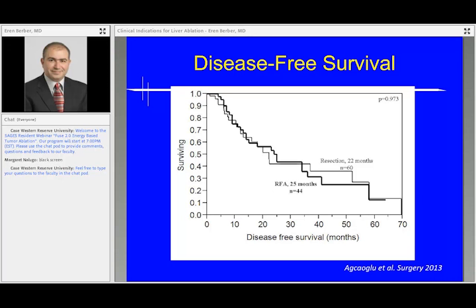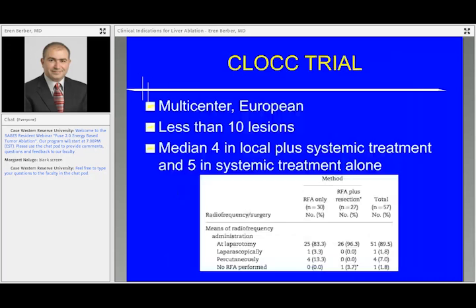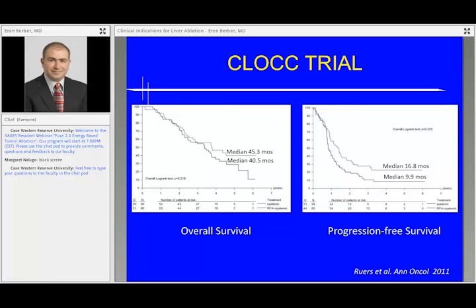If you have a small tumor, you're going to take that under control with ablation. If it recurs, you can follow the patient closely and resect or ablate for salvage therapy, then the outcome should not be much different, unless the biology is different. This is probably one of the most important pieces of data related to the benefit of ablation. It's the CLOCC trial, a multi-center study from Europe that randomized patients into systemic therapy versus systemic therapy plus ablation. With less than 10 lesions, pretty much similar to the patient population we treated, the patients ended up having about 4 lesions in the combined treatment arm and 5 in the systemic treatment arm.